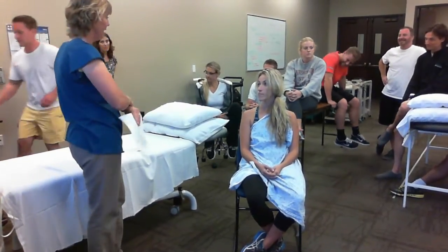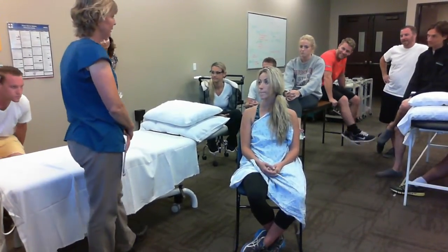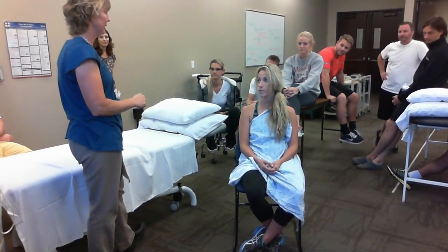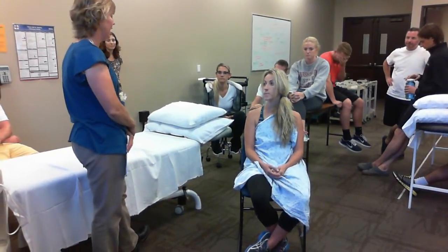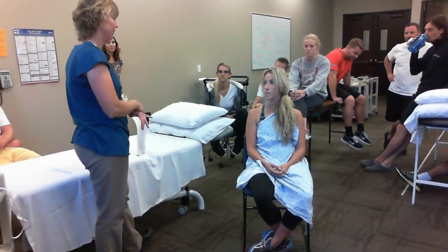So Lily, what I have in mind for you today to treat that shoulder pain that you're having from the surgery, that acute pain that you're in, is to use a little bit of electrical stimulation with a cold pack on there. And what you're going to feel with the electrical stimulation would be just a light tingling sensation, very comfortable. And with the cold pack, you're going to be feeling kind of a sequence of cold, burn, ache, numb. That'll take about 5 minutes.